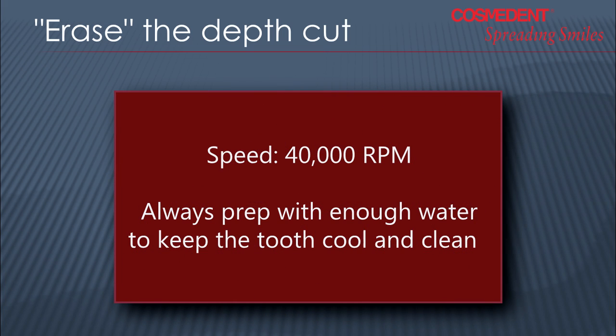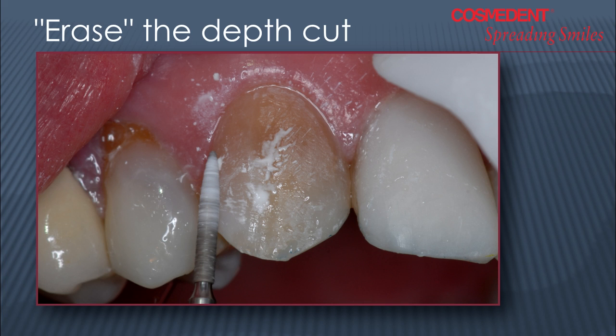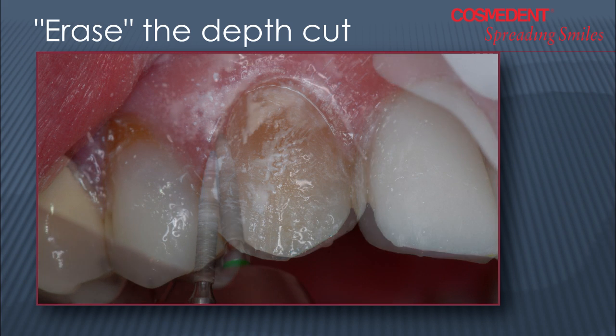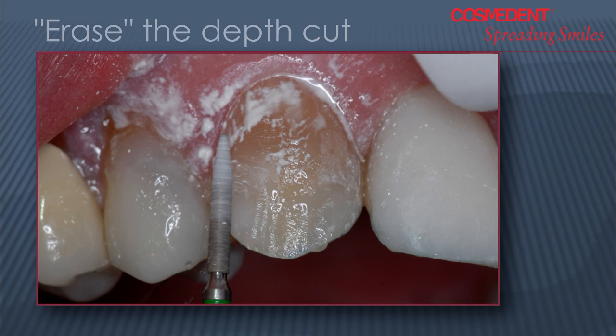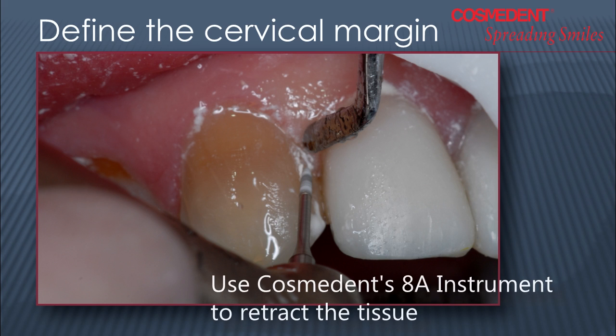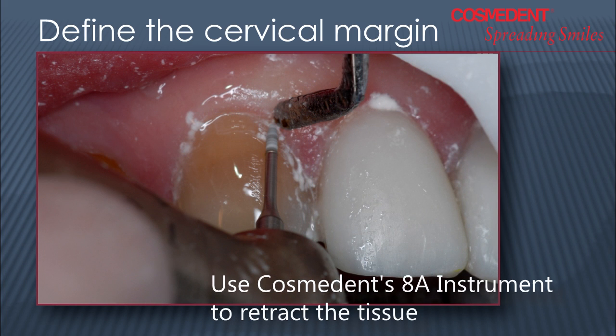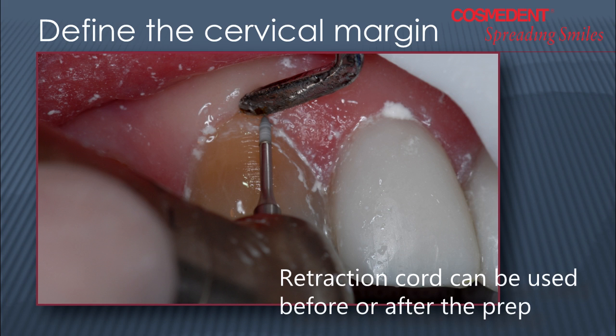The amount of water you use is determined by the operator, but you want enough water spray to keep the area clean and cool. Once I've got the mesial half of the tooth surface removed, I'm going to prepare the distal surface in the same manner — tipping it from incisal to gingival to follow the convexity of the tooth and erasing out that depth cut. My next step is to define the margin beneath the free gingival margin. Here I use a retraction instrument — it can be an 8A instrument, a chrome instrument, anything that will protect the tissue from the burr. You can pack a retraction cord prior to or after your preparation.